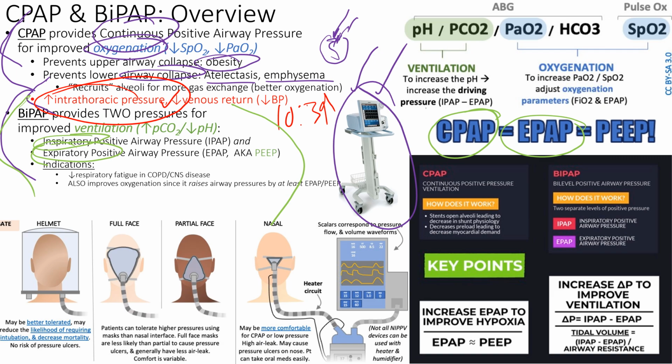But it's going to help ventilate someone, right? So if you have an EPAP of, let's say, 6, and you go to 12, that difference is a volume of some sort. So I start at 6, and when they take an inhalation breath, it's going to go up to 12, and that's going to pull that much volume. If I change it to 16 over 6, and it starts at 6, they go all the way to 16 over 6. That's going to be a bigger volume, right? So I have 16 over 6, for instance. That's a bigger volume, and we'll explain that on a slide coming up.